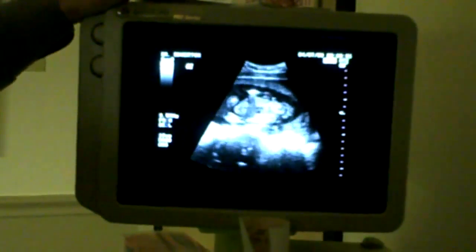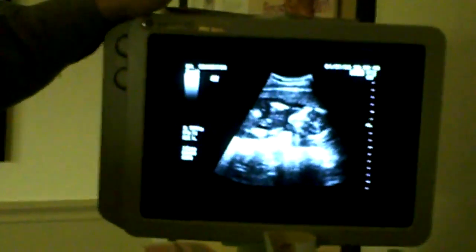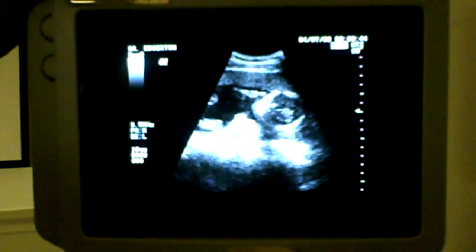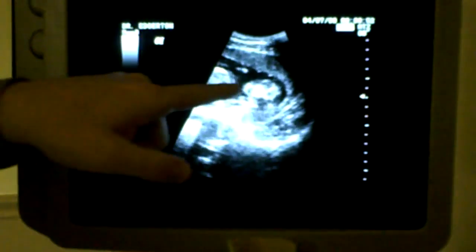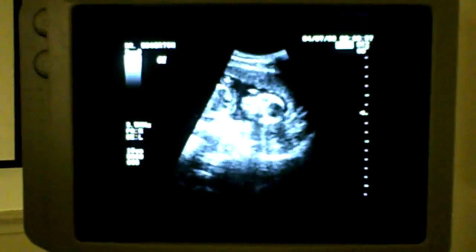There are two little arms here, see baby's moving around. Let's see if we can get a little face shot — it looks very skeletonish, but you can see eye, eye, mouth. They do look like little aliens at this stage of the game.